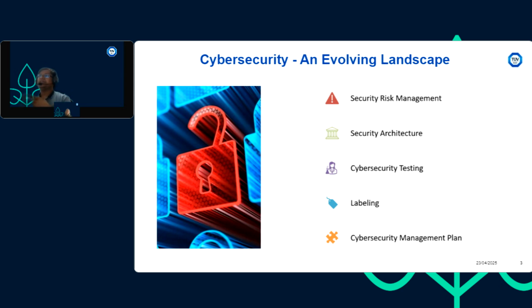So how are we going to identify the bugs, what will be the frequency cycle, when are we going to provide the security updates, when are we going to inform the end user, how are we going to protect against attacks, and how are we going to notify the regulatory bodies about incidents. All those things we need to do in the cybersecurity management plan.